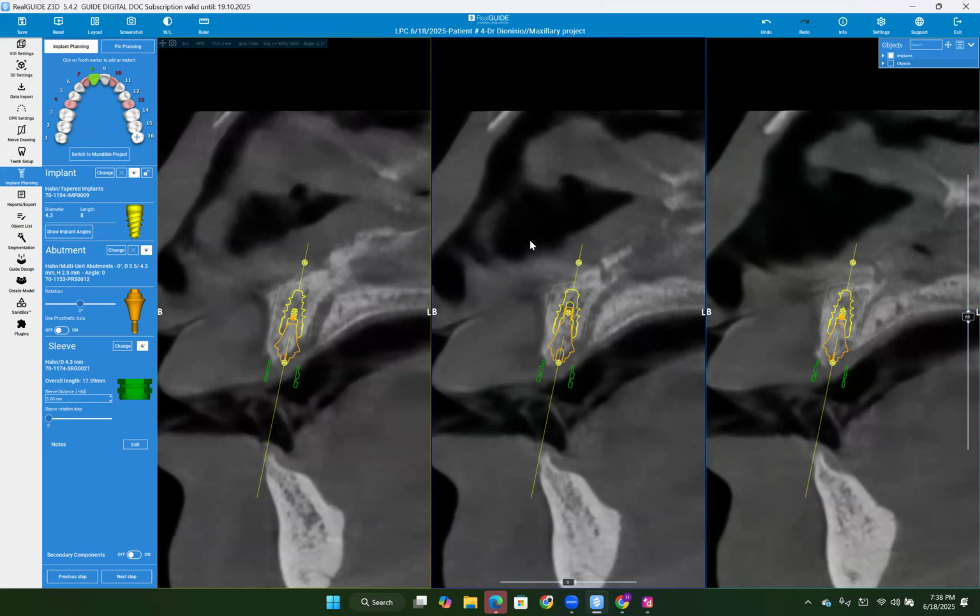I see. I was able to get an exocad, a virtual smile design, from my lab. If that smile design is pretty accurate and usable, would I still need to have an interim prosthesis made? No, no. If the exocad is accurate, that would help. Now, what's difficult with the exocad is you're just looking at it digitally there, correct? Are you printing a provisional with that and trying it in? Right now it was just at the very beginning of the process. Okay. So what they can do is print a smile transition off that, so you wouldn't need to make them.